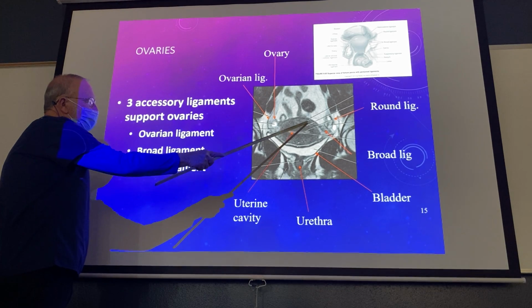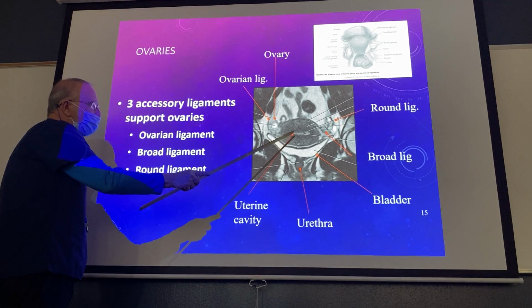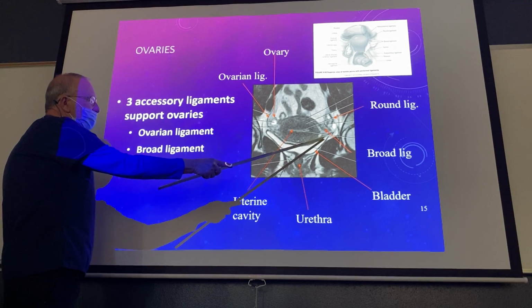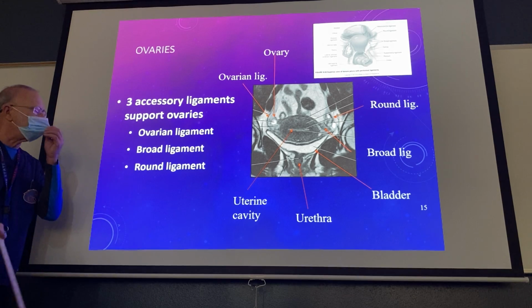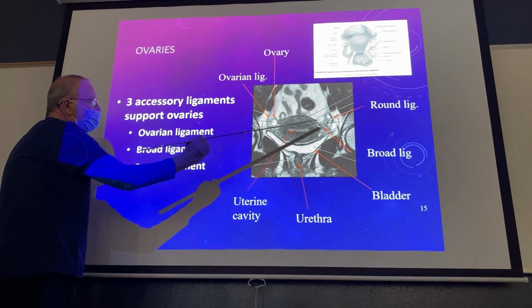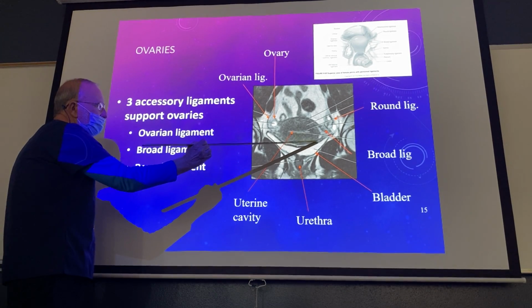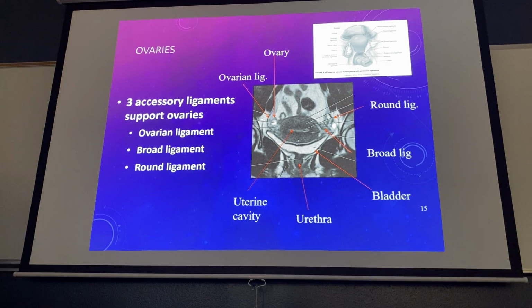The uterus, again, is going to have a very thick myometrium, the muscle itself, and then you have the smaller, in this one instance, of the uterine cavity. The bladder is semi-empty, so that's what you're seeing over here, and the urethra would be below it. So broad ligament, round, I'm not too worried, it's running linear like this. Here's ovarian ligament, hard to pick up. Here's your ovaries on both sides. Back over here is your bladder. Down here would be the vesicouterine pouch, which doesn't really stand out, but we simply know about its location.